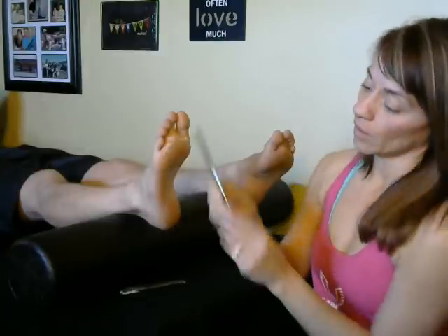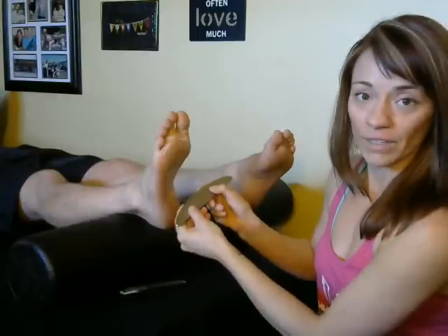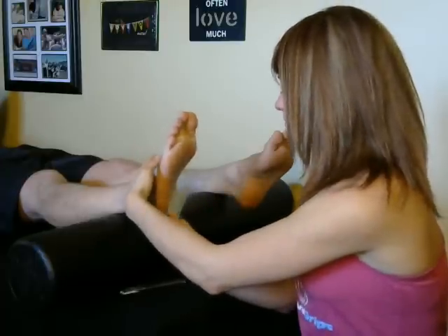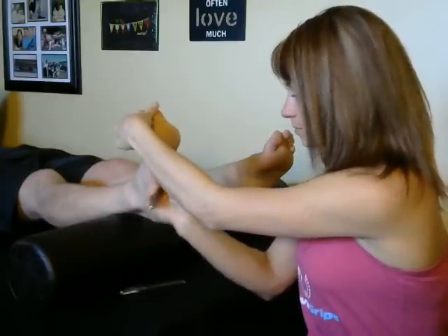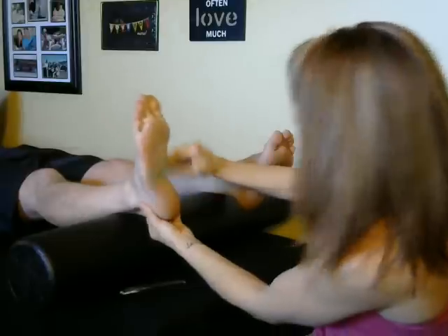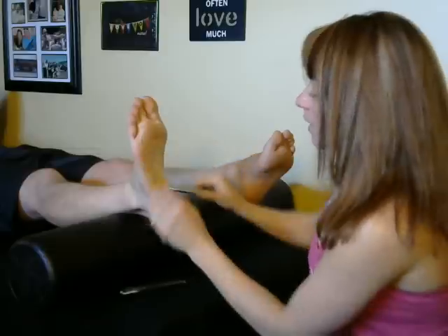To begin, you'll see that the tool has a bevel side — you don't want to go with the bevel facing the opposite way. Think of it as shoveling snow: you wouldn't shovel with the shovel side down. First, I'm just going to scan, putting a little bit of stretch on the tissue to see what I feel. Notice there is hardly any wear and tear on me. I can feel little reverberations in the steel itself.